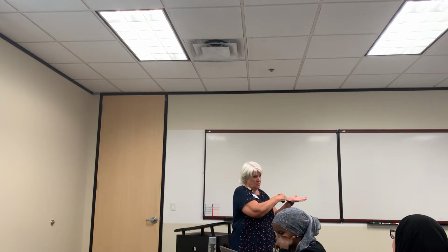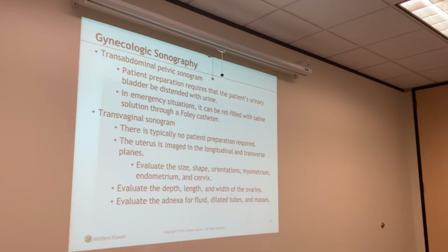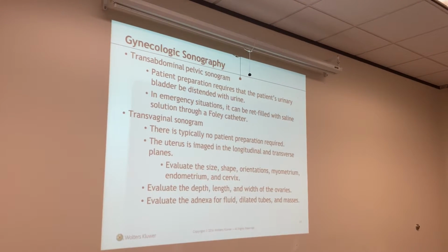Okay? If I'm sagittal, I still have left and right. But if I'm transverse, I'm really coronal. Don't confuse the radiologist. Put transverse on there. Okay? There is no preparation for a transvaginal ultrasound.